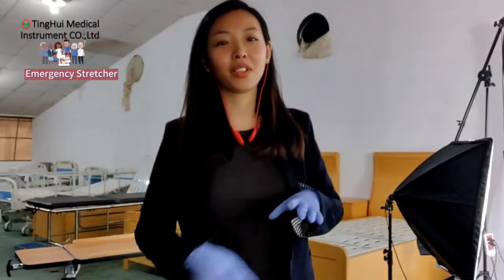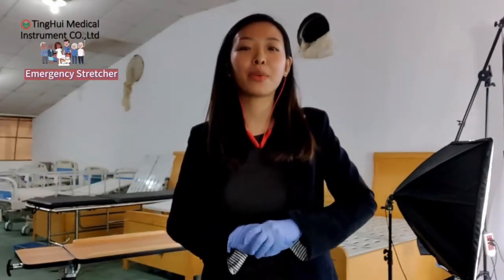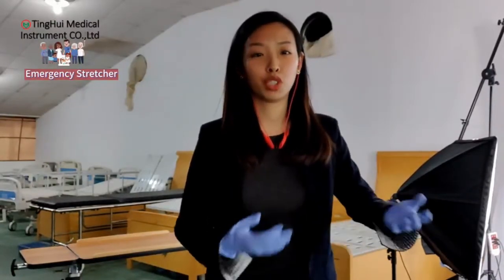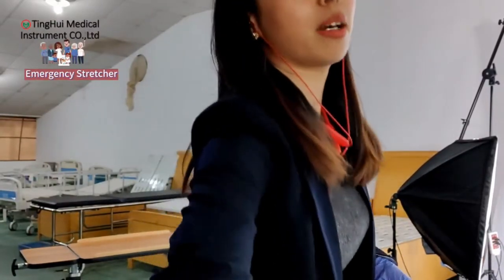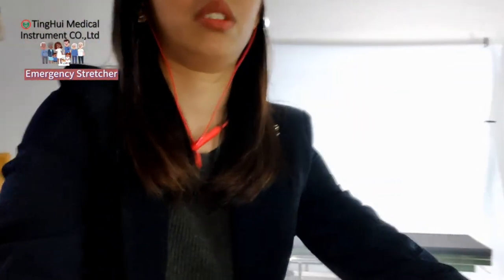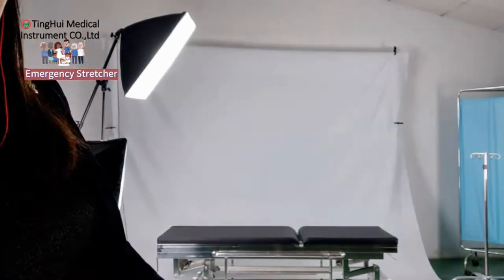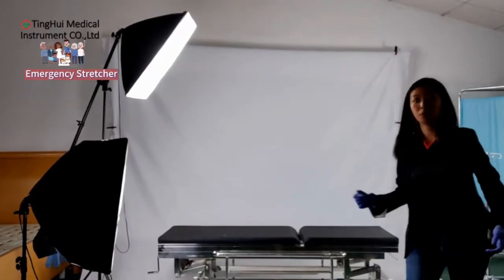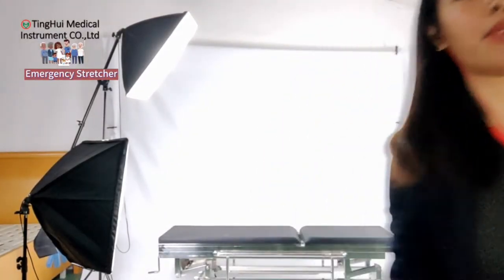Hi everyone, this is Betty and I'm working in the medical industry. Today I would like to show you more about our product, which is meeting the market right now. It is helping doctors and nurses save more time to care for patients. I would like to show you about the sculpture — we call it that — and it has several functions.